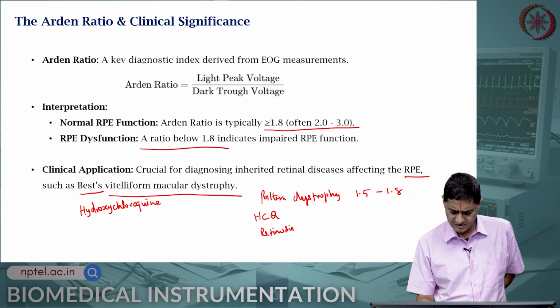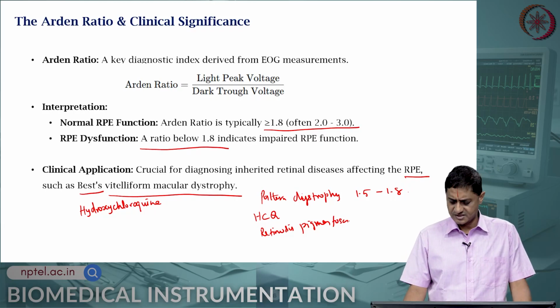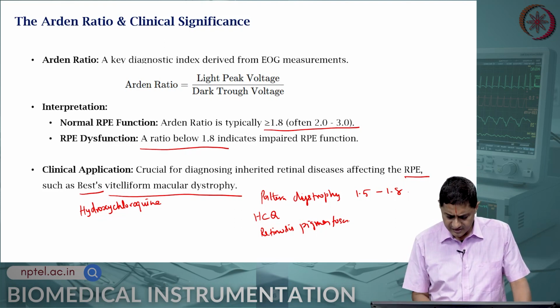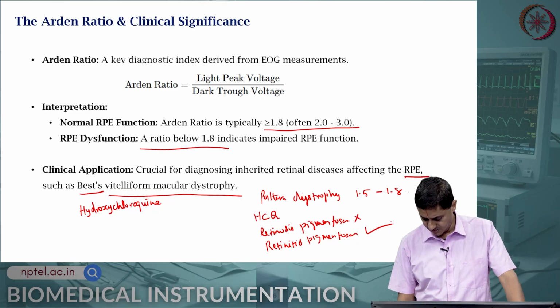We have seen this. EOG is used for differential diagnosis of this disease also. In the video I said that this is actually retinosis pigmentosa, this must actually be retinitis pigmentosa. Slight mistake, this is wrong, this is right, something to keep in mind.